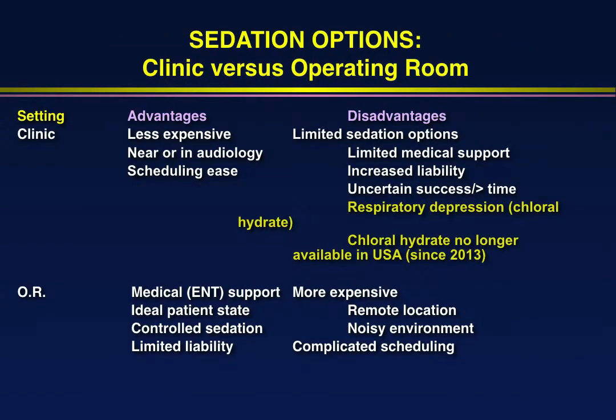There are advantages to using sedation in a clinic, quite a few advantages. It's not that expensive. It's quite easy to schedule a patient if you're in a medical clinic. We always used a nurse and we always had a pediatric otolaryngologist nearby. And another big advantage is you have all your audiologic equipment there, your tympanometer, your OAE device, everything else.